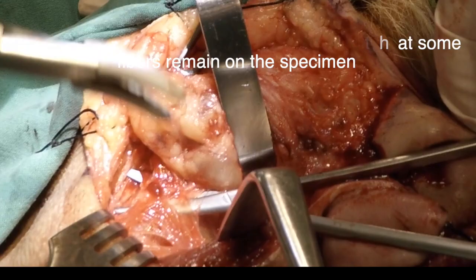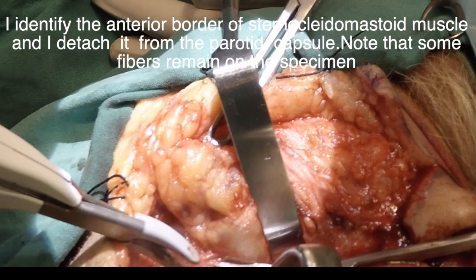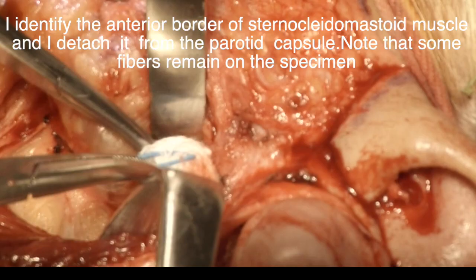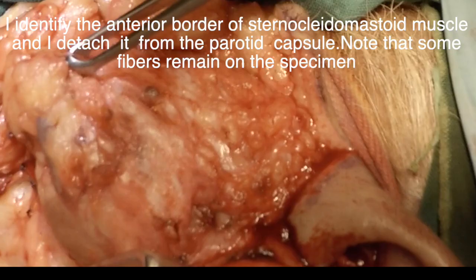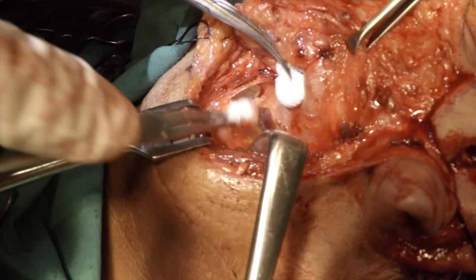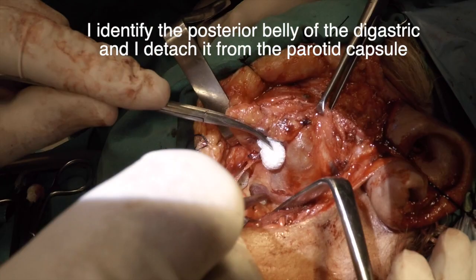I identify the anterior border of the sternocleidomastoid muscle and I detach it from the parotid capsule. Note that some fibers remain on the specimen. I identify the posterior belly of the digastric and I detach it from the parotid capsule.